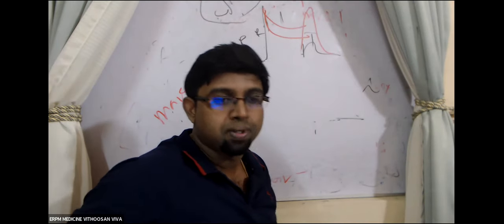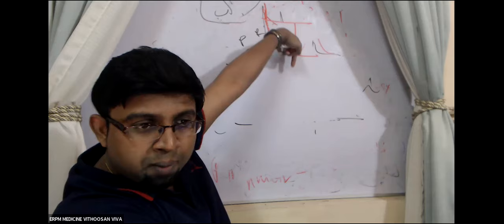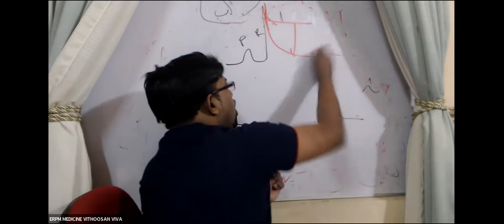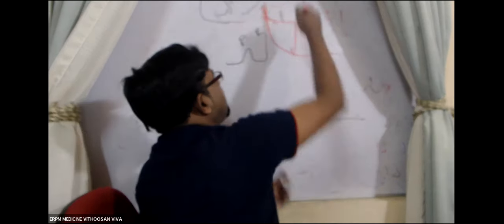Then what will happen is, this ST segment which has gone up will come down. Sometimes it will keep coming down. When it comes down, the normal T wave is like this, no? Normal T wave is upward, isn't it? Upright.